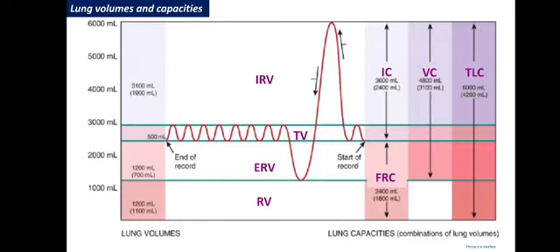This is the lung physiology. The patient is now in the tidal volume. Now asked for deep inspiration, he or she will reach the level of inspiratory reserve volume. Then ask for total and complete expiration. Air is blown out, and he or she will reach the level of expiratory reserve volume, and after that come back to the baseline tidal volume.